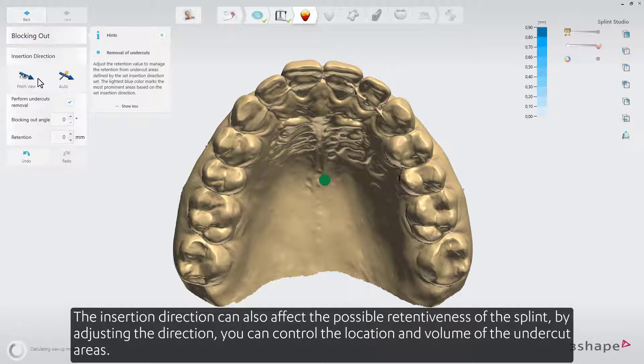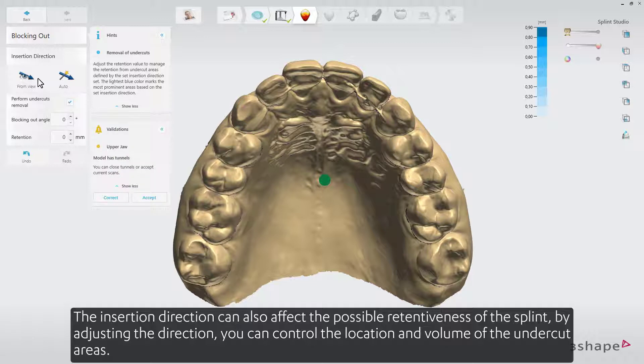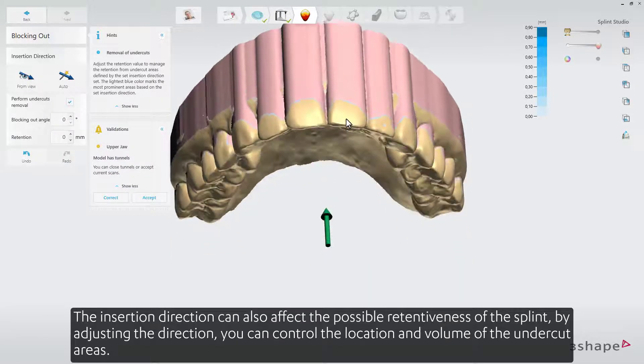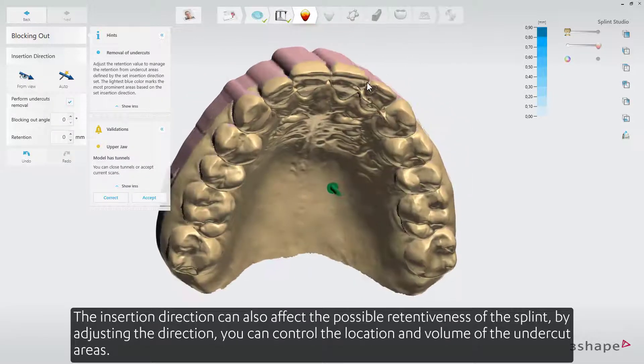The insertion direction can also affect the possible retentiveness of the splint. By adjusting the direction, you can control the location and volume of the undercut areas.